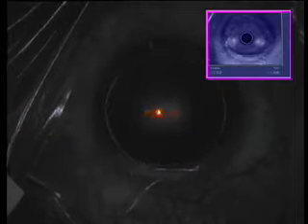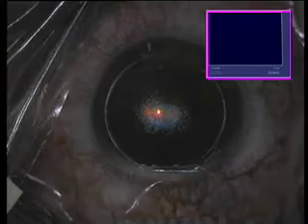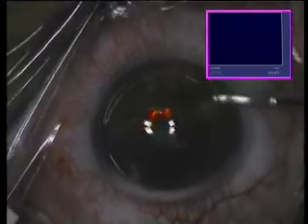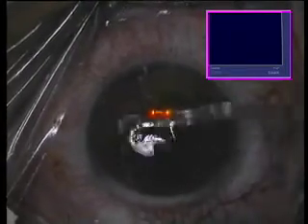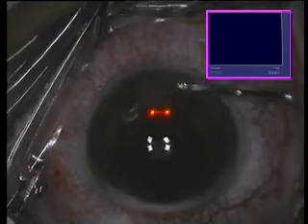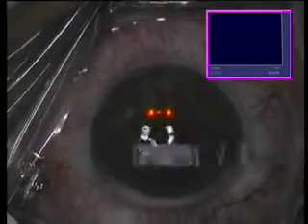A small intermission to attain a homogeneous dry bed. We can see the hypofluorescence of the multiple flying spot laser on the surface of the cornea. After our procedure is finished, we will bring back our flap into place, hydrate and wash the interface copiously in order to avoid any interface debris, and conclude our LASIK procedure in this right eye. Again, this is a topography-guided hyperopic ablation.